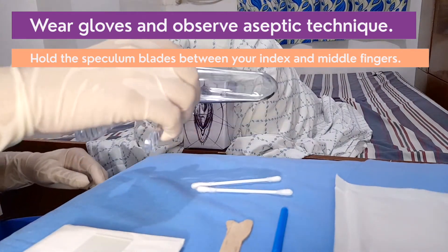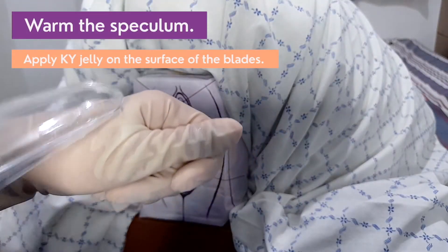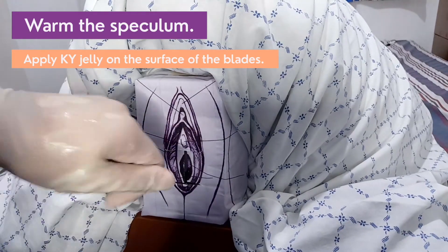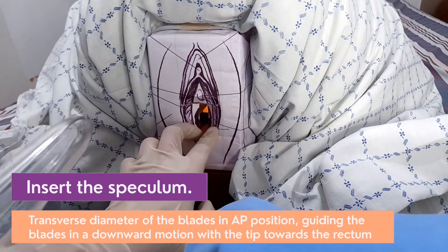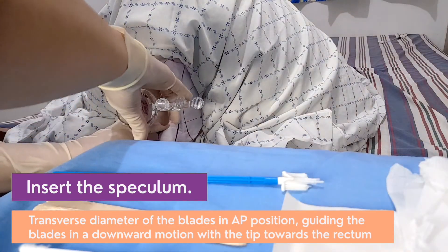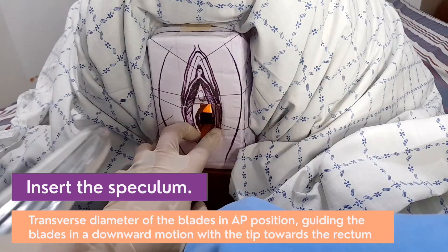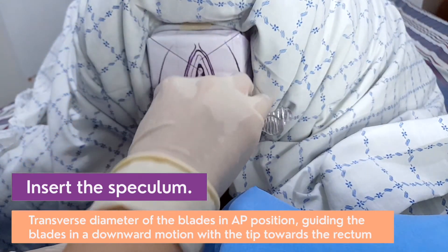Hold the speculum blades between your index and middle finger. Warm the vaginal speculum. Apply KY jelly to the surface of the blades. Insert the speculum. Facilitate the insertion by placing two fingers into the introitus and pressing down. Place the transverse diameter of the blades in the anterior-posterior position, guiding the blades through the introitus in a downward motion with the tips pointing towards the rectum.